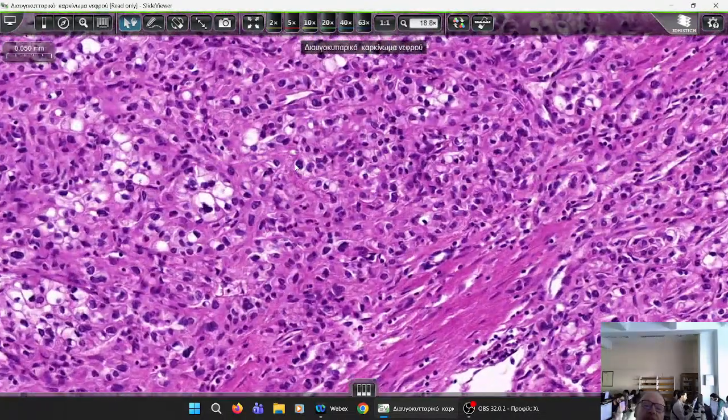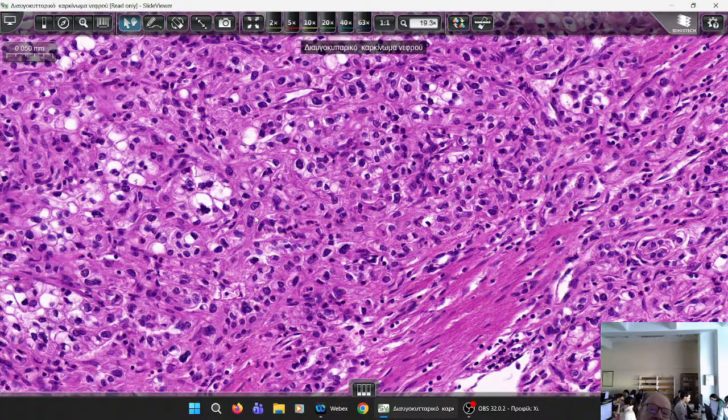Ah, yes, this is different. And it's very easy to say why it is different, because many cells have a granular cytoplasm. So, if we have a subpopulation, or even the predominant population of cancer cells having a granular type of cytoplasm, we also need immunohistochemistry to define it as a clear cell carcinoma. Why? Because it is not clear. It has granular cytoplasm. So we perform carbonic anhydrase 9 immunostaining. If these granular cells are positive, we diagnose this as a clear cell renal cell carcinoma, despite that the cells are not clear everywhere.